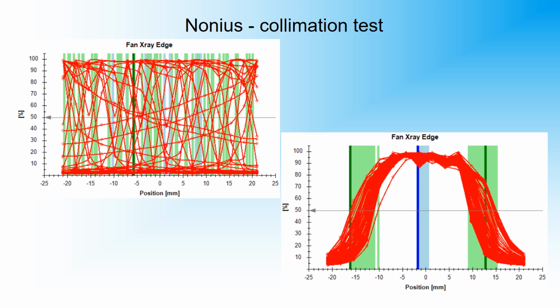There you see the center doesn't change, changes about the blue part of the graphics, and the width changes a bit as the fan hits the array from the side.